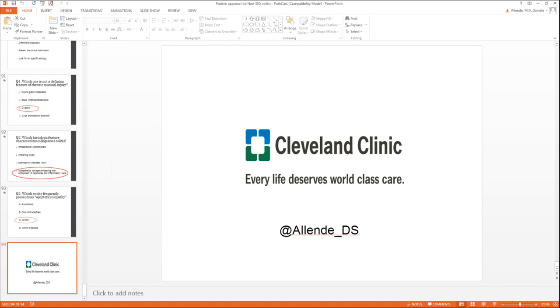That should make us pause before we call something frankly neoplastic in that setting. But purely histologically, I would say in cases of reactive change, you're going to see increased NC ratios, sometimes some nuclear hyperchromasia, sometimes stratification, all those features, and even mitotic figures, things that we typically see also in neoplasia.